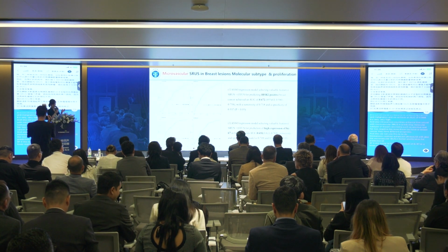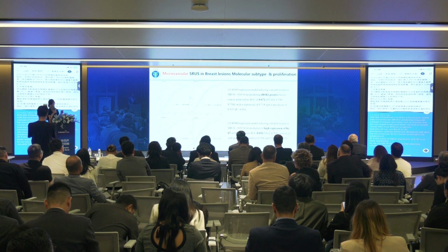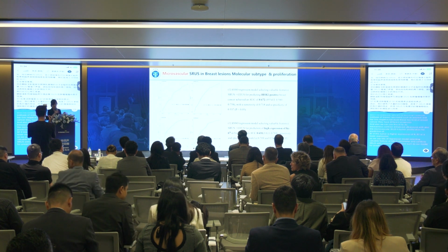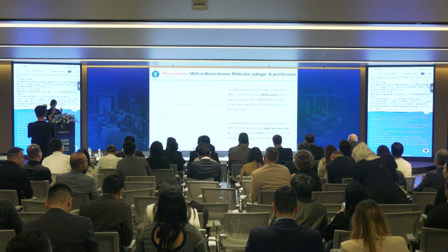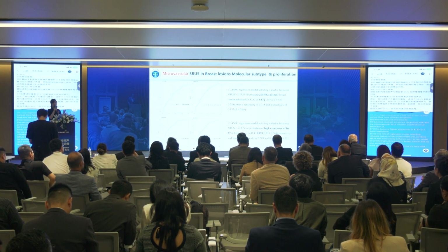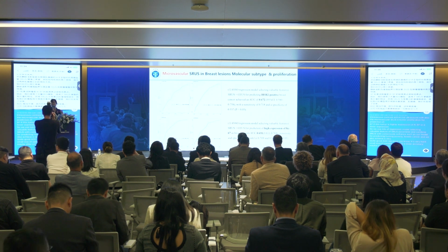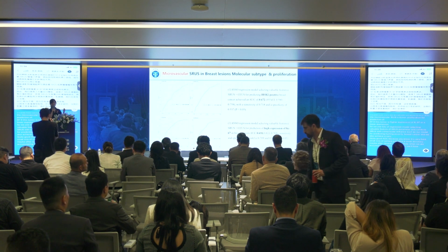So we use a Lasso regression model selecting valuable features of SRUS parameters and combine SRUS with a contrast-enhanced ultrasound model for predicting HER2-positive breast cancer. And we also achieve a quite good AUC, though a small sample size just gives a lower accuracy. But maybe after several years of study, when we accumulate a lot of cases, then we will have higher diagnostic accuracy.